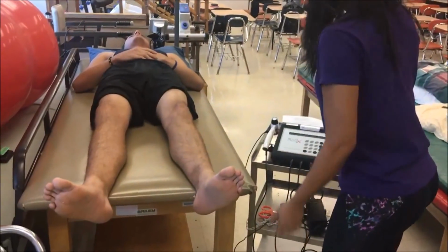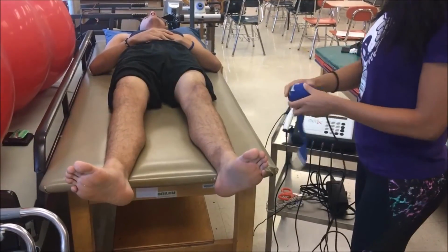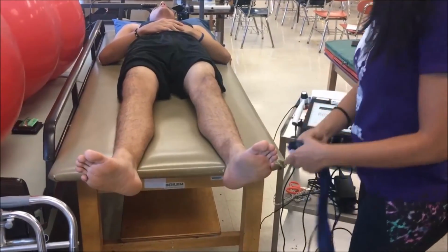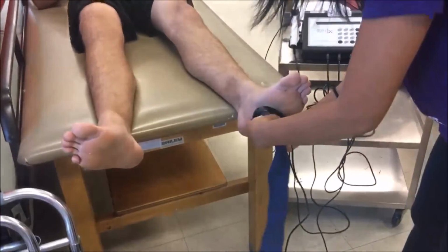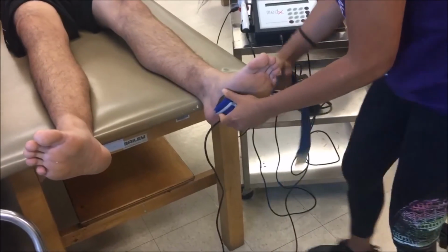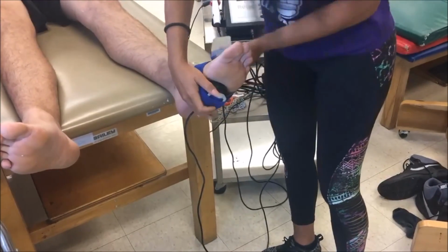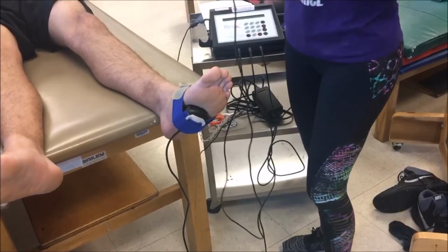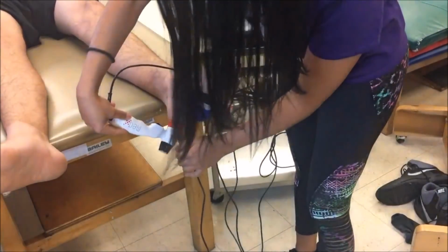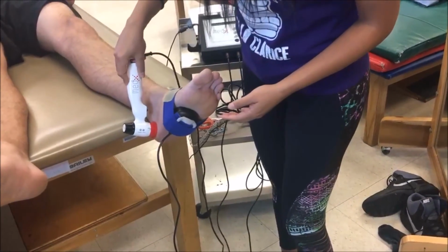We can also treat plantar fasciitis with the laser. We can place the SLD on the plantar side of the foot, more in the middle. And then with the laser, we can put the laser on the calcaneus in different areas.